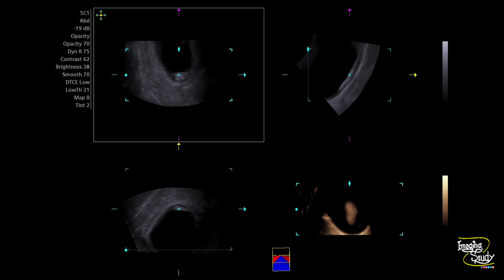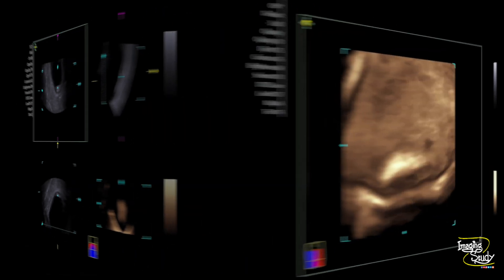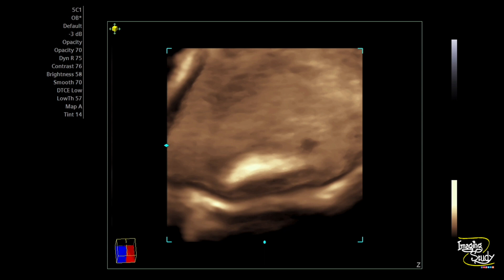If you have a 3D ultrasound facility, you should use it to evaluate luminal structures — it is a good way to practice 3D. My machine didn't have a volumetric transducer, so I used the regular curvilinear probe and moved it manually to get a 3D image. This may not be as good as a volumetric transducer, but it is usable. Here you can see the three-dimensional image of the urinary bladder calculus within the lumen.